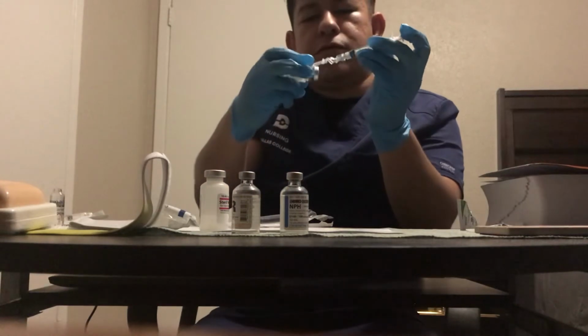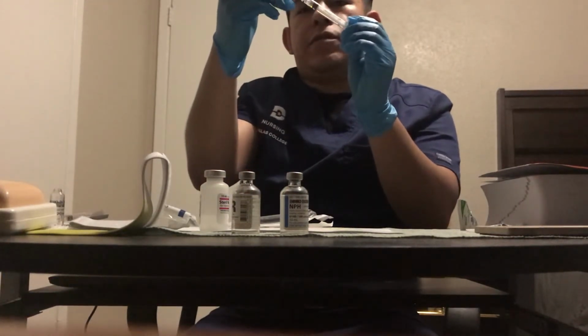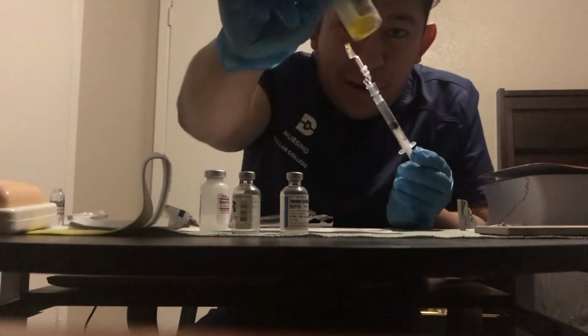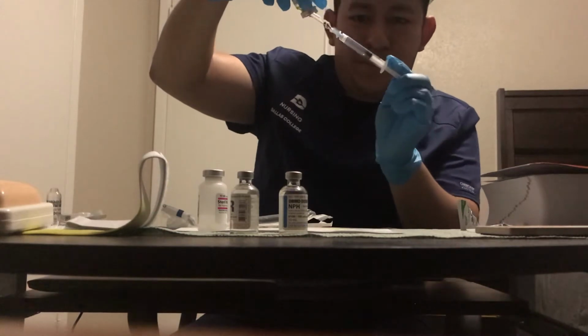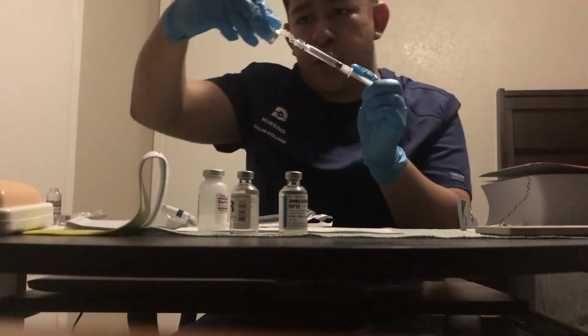Then you slowly and carefully pull back out 2.5 mLs of ceftriaxone, which, as you can see, I've already practiced with this, so it's empty, but it's basically almost the whole thing. You want to make sure you get all of it because it's an antibiotic, so it's important.